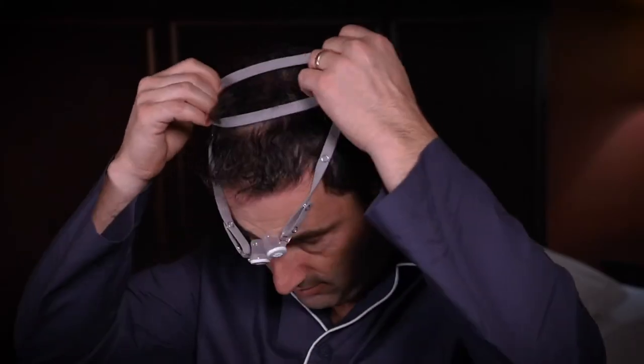Stretch the headgear over your head and gently insert the Bongo RX into your nose. Adjust the headgear as needed for comfort as described in the instruction manual.